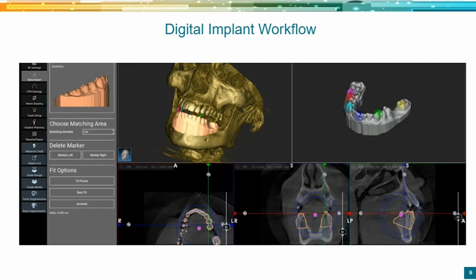On the bottom 3 slices of the CT, the axial, sagittal, and coronal, we're looking at the outline of our model and making sure that it's wrapping the hard tissue data in the scan. You can really appreciate it on the lower left in the axial slice. When the cusp tip pops into a slice, so does the model. We're wrapping the buccal and lingual and so on. So we're making sure we have a really good stitch, in which case we hit accept. If we're off by a couple tenths of a millimeter, your placement's going to be off by a couple tenths of a millimeter. So we have to be really mindful of that.